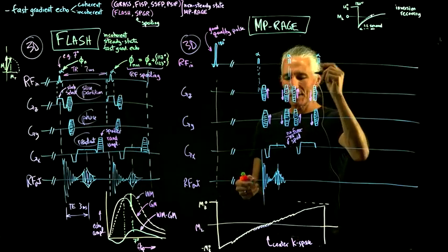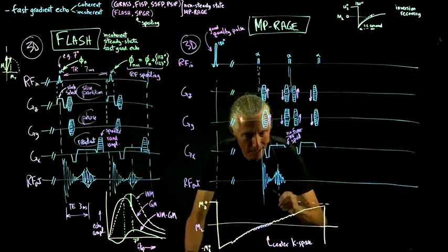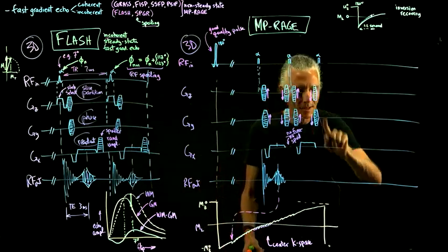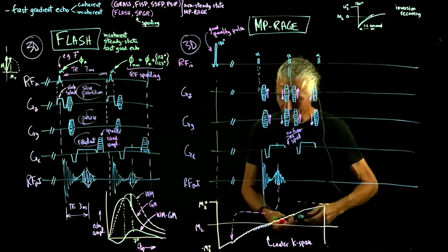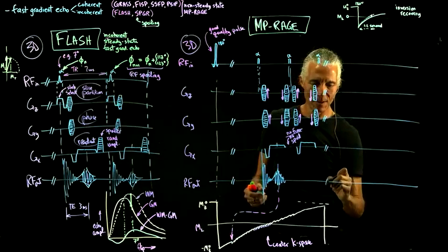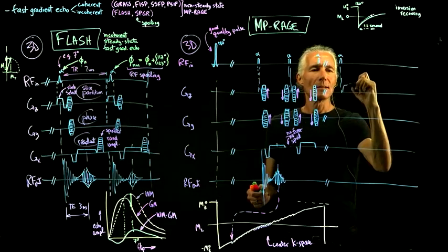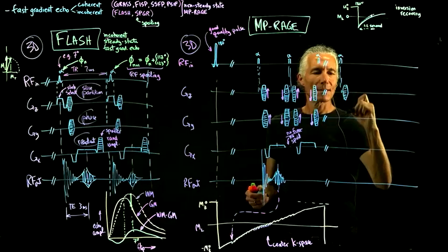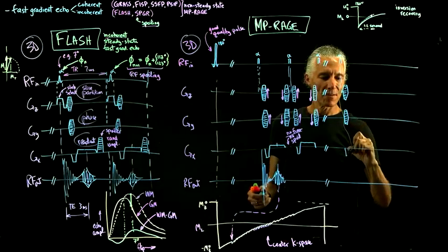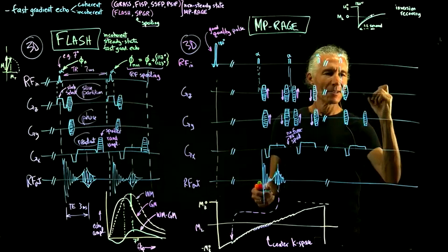And then of course these would be these. So this guy, let's sort of annotate. This echo is going to be this guy down here, and then there'll be a lot of time before we eventually get to the center of K-space. 100 echoes later, we get to the center of K-space, and so here's the alpha for the center of K-space. And so we have our phase encode here, phase encode, readout, phase encode fixer, another fixer here.